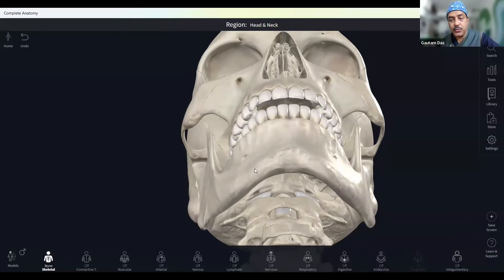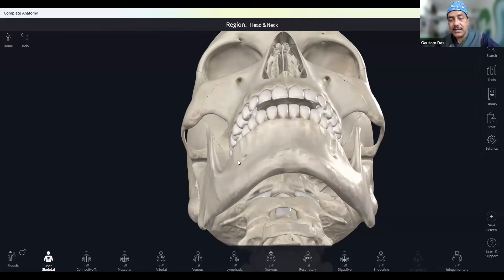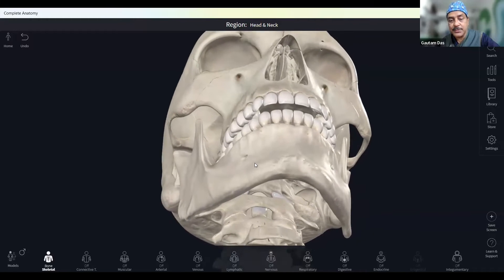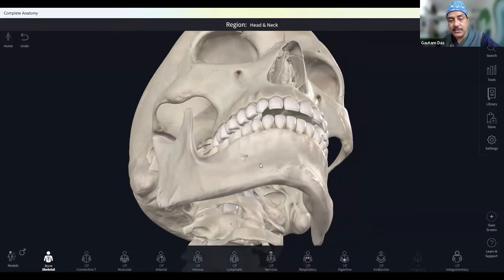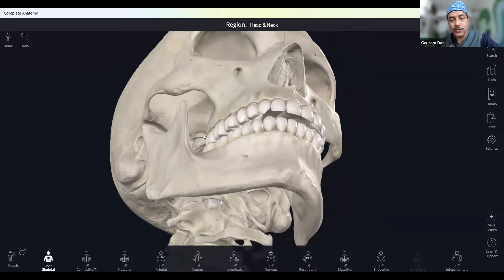So what do you have to do next? You have to rotate the face towards the opposite side. If you are looking for the foramen ovale on one side, either you rotate the head to the other side, or you make an ipsilateral tilt of the C-arm. Now I can see the foramen ovale here — this is your foramen ovale through which the mandibular division is coming up.